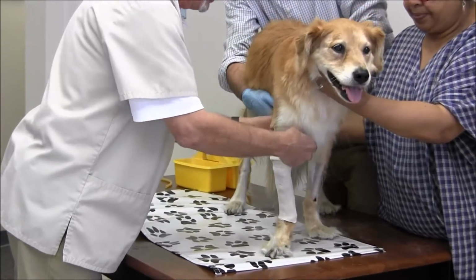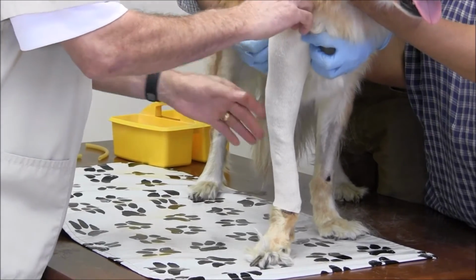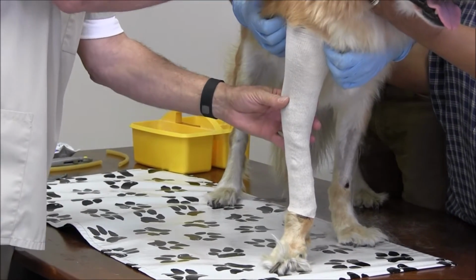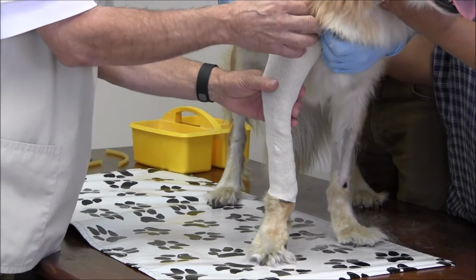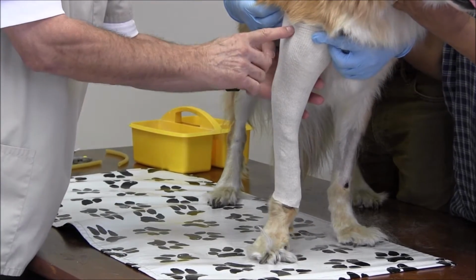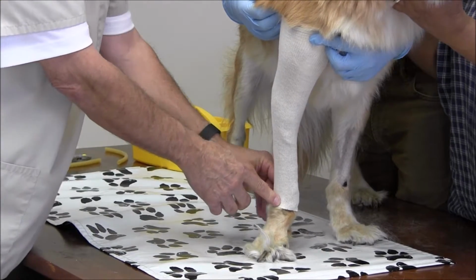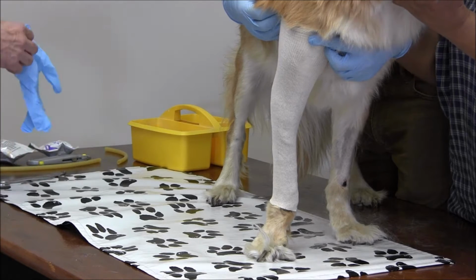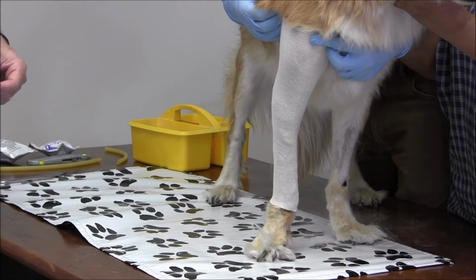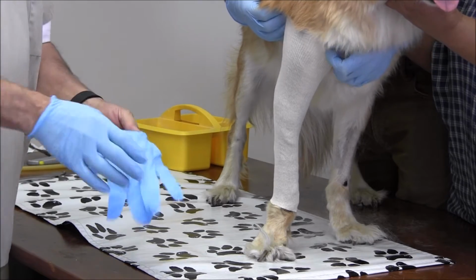And we're going to hold the stockinette as high up into the axilla as possible. It's always best if you have a helper that would hold up the stockinette. We're going to cast from as high up in the axilla as possible, and we're going to cast all the way down to the carpus. So what we want to do is put the stockinette on. We'll put our gloves on.